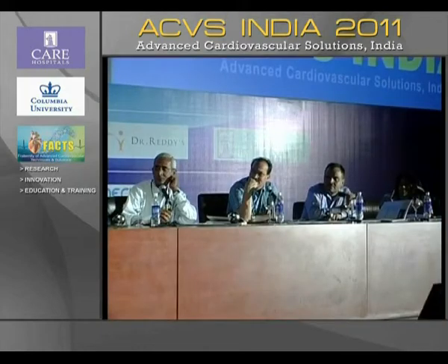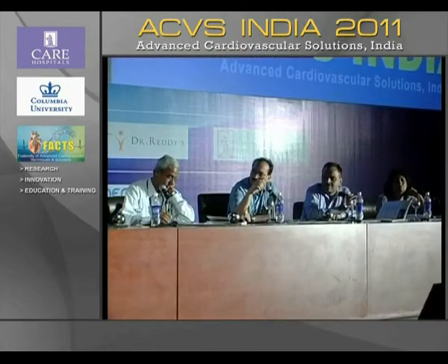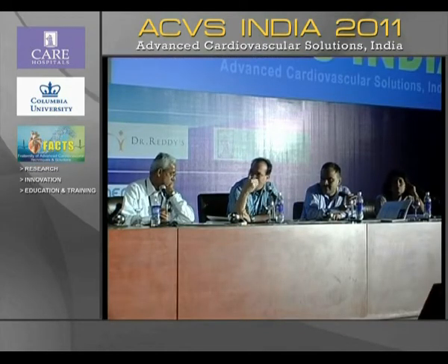But the patient had pericardial effusion before you put in the covered stent? Yes, after putting the covered stent, the patient had a pericardial effusion. Before that, I was observing the echocardiogram closely. He had a very thin film of pericardial effusion, and the effusion became quite gross and hemodynamically unstable only after completion of the procedure. The literature says that normally in coronary perforation, one has to go step by step.